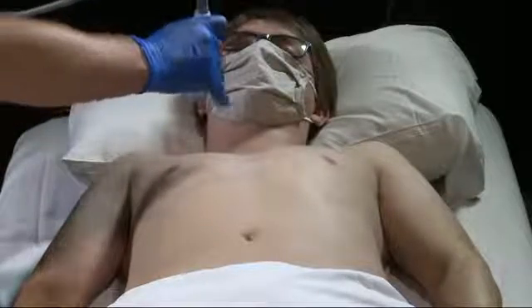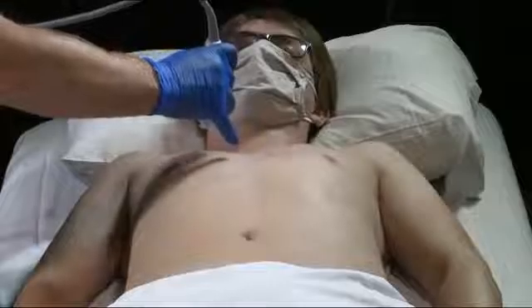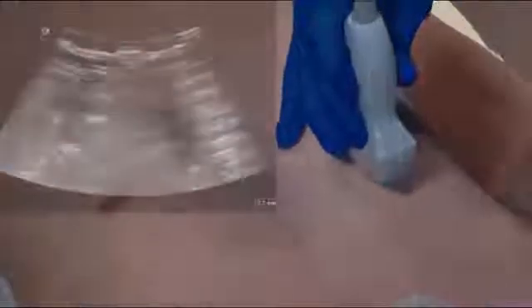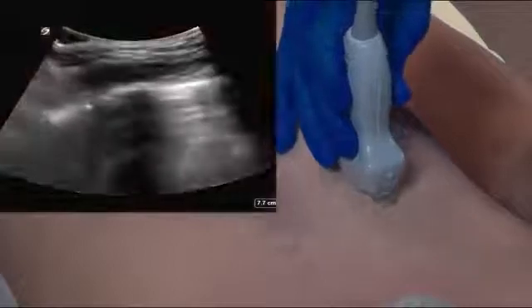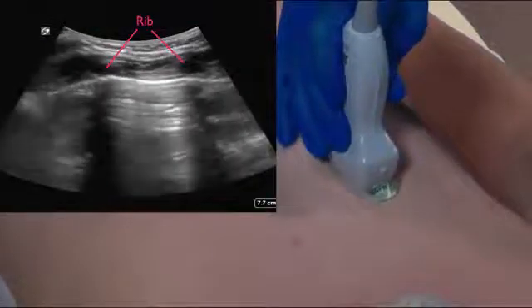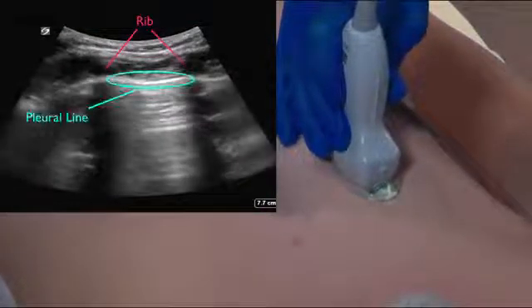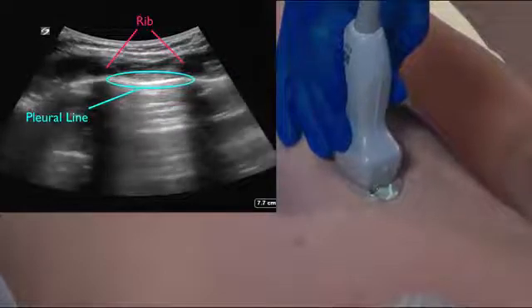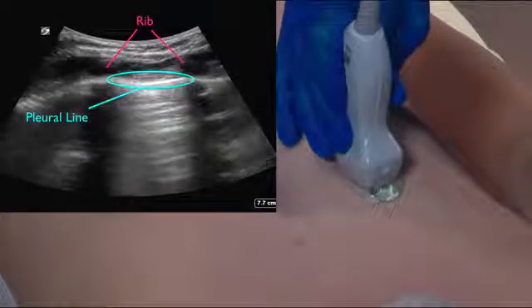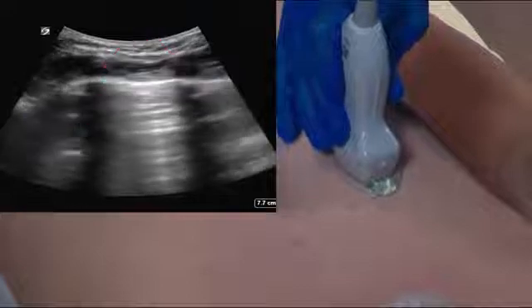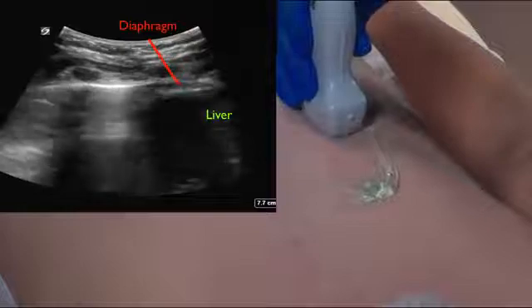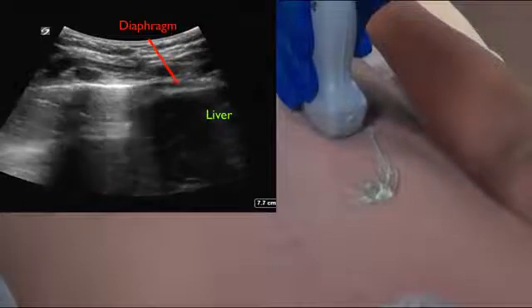We're going to place the transducer along the mid-clavicular line just above the patient's nipple. We're going to place the transducer down, identify a rib, identify the intercostal space, and then the pleural line. Once we've done this, we're going to drag the transducer just below the nipple, looking for lung sliding throughout.